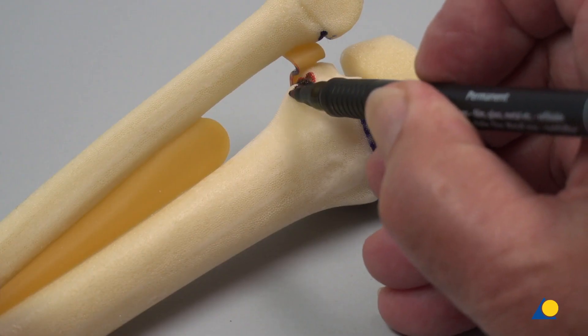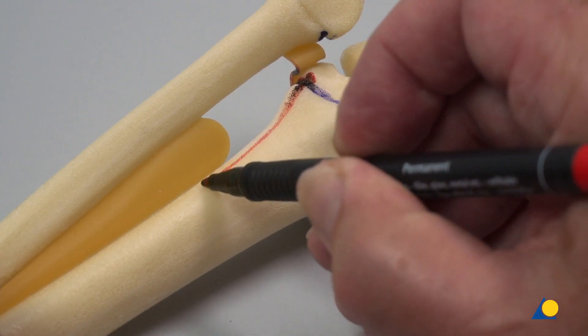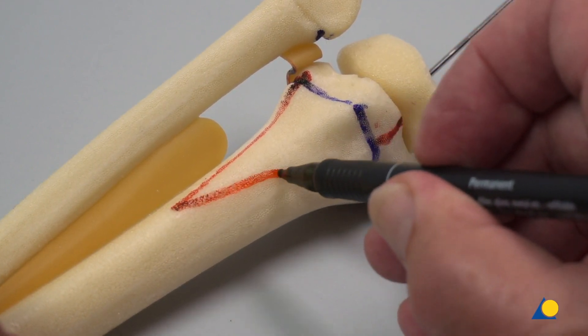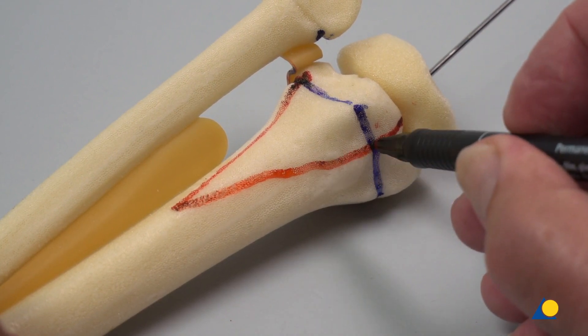On the posterior side of the tibia, the 3-4 cm long triangular metaphysial fragment, which represents the Salter-Harris type 2 fracture, is marked.